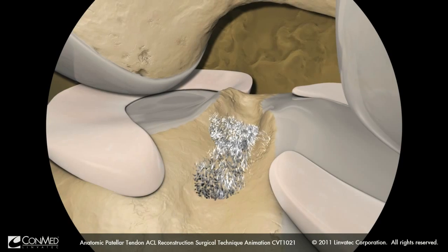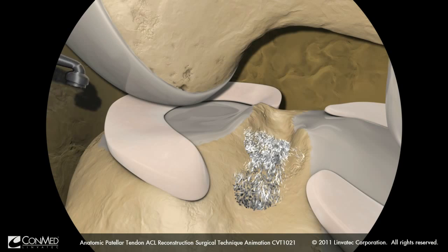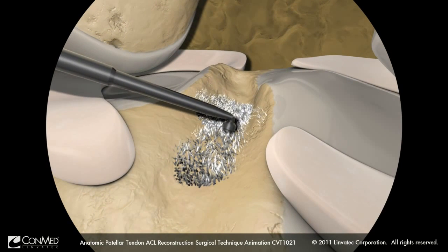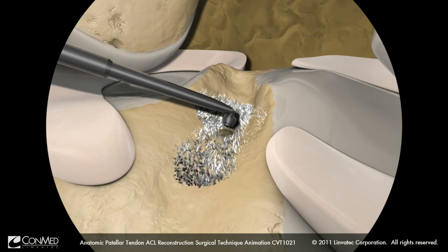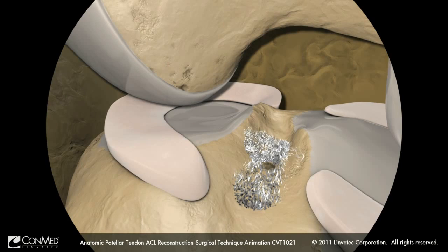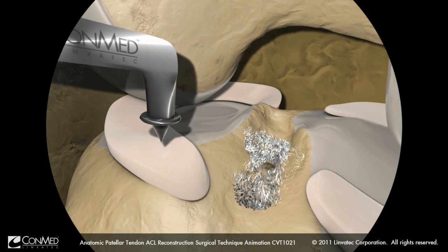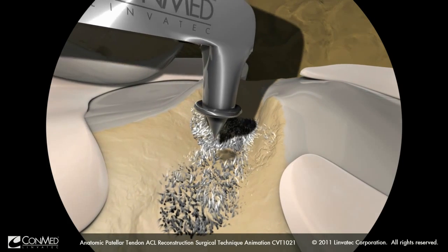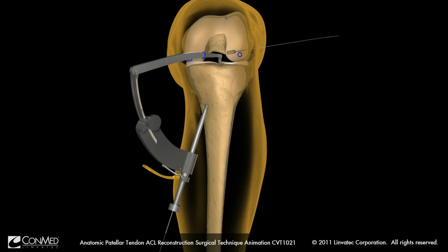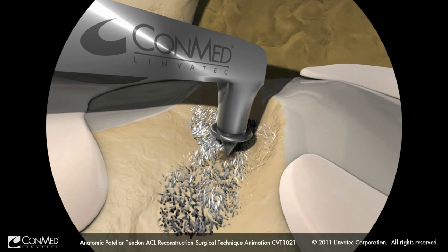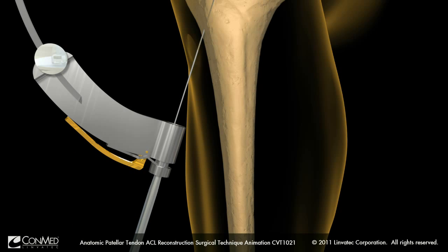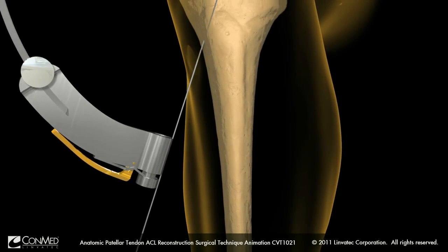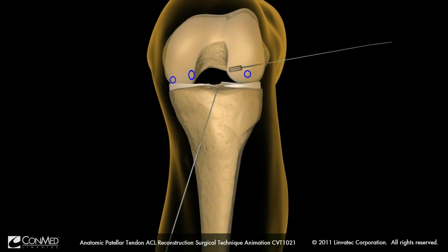Switch the arthroscope to the anterolateral portal. Insert the light wave ablator into the anteromedial portal to mark the center of the tibial ACL footprint. Set the angle of the pin ACL guide to the desired settings. Insert the tip into the anteromedial portal, placing the tip of the guide into the center of the tibial ACL footprint. Advance the external guide sleeve flush to the anterior tibial cortex. Using the ConMed Linvitec M-Power 2 handpiece and pin driver attachment, advance the guide pin until it meets the point of the guide arm. Then depress the pin ACL drill guide lever to remove the sleeve, and remove the pin ACL guide from the guide pin and joint.